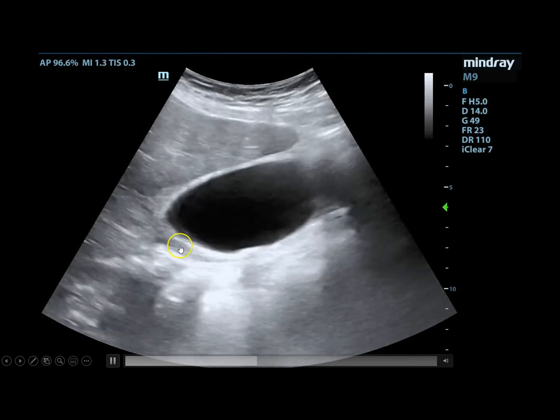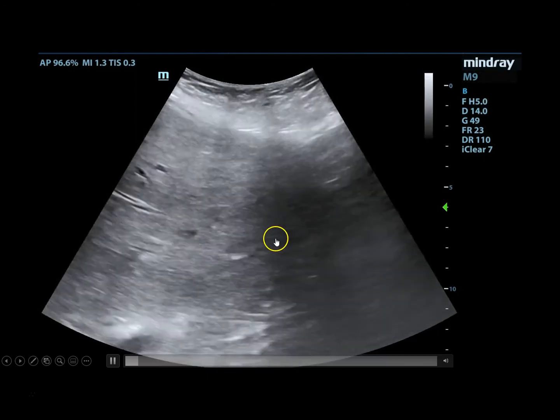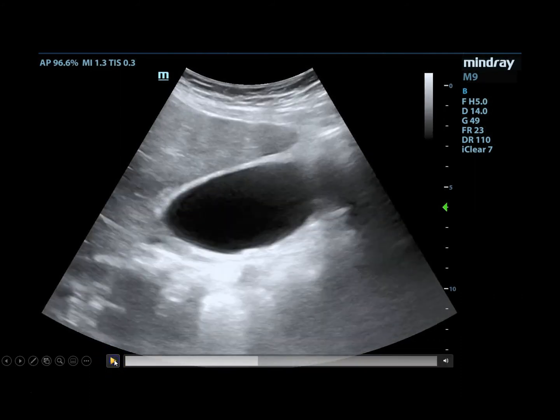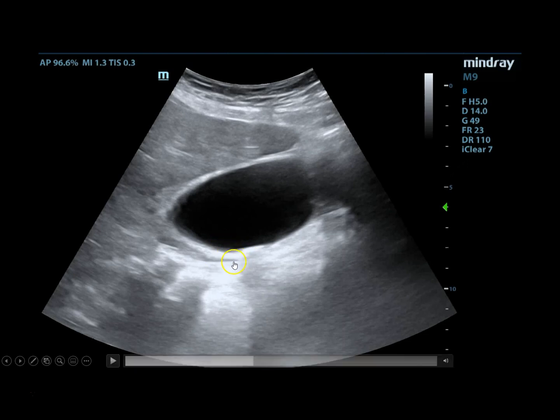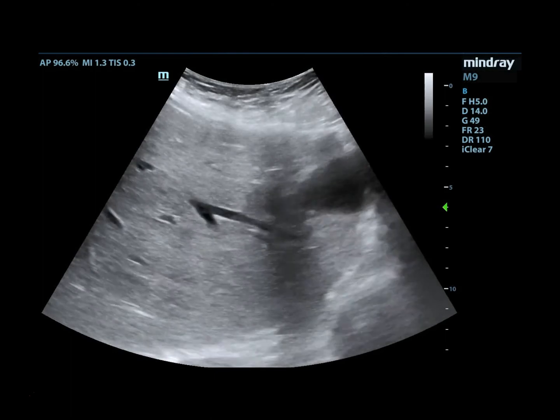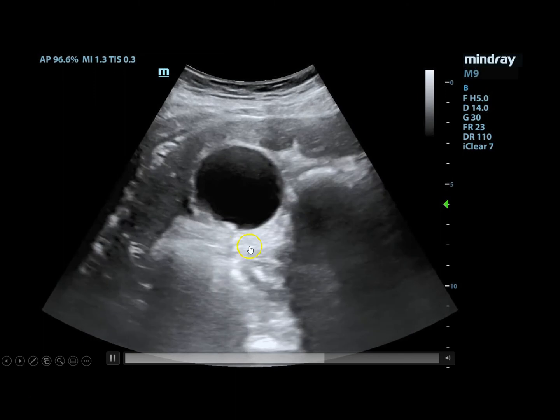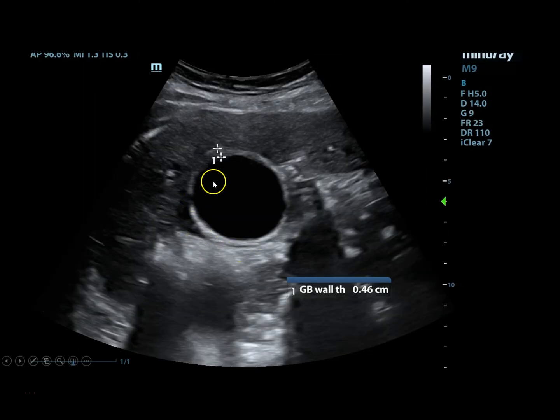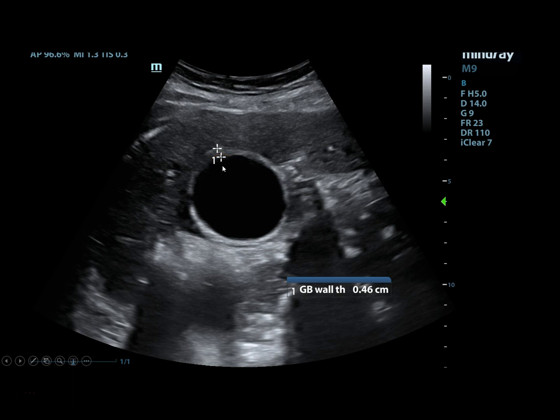In the long-axis view of the gallbladder, there are no obvious stones, but there is a tiny stripe of fluid starting to appear around the gallbladder. When in doubt, grab another view — rotating the probe 90 degrees to get the short-axis view, which looks mildly thickened. Measuring the wall comes out to 0.46 centimeters, which is enlarged. There is also more pericholecystic fluid visible. This was concerning for the patient having cholecystitis.